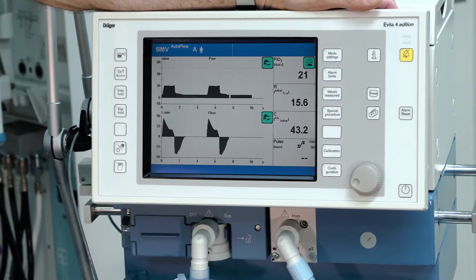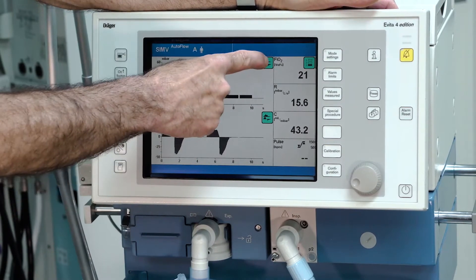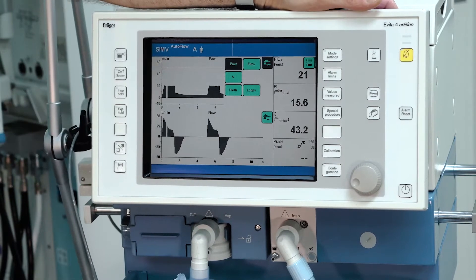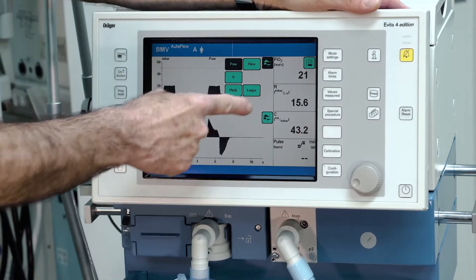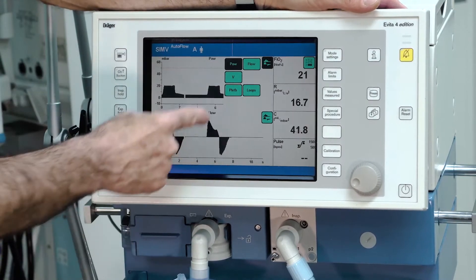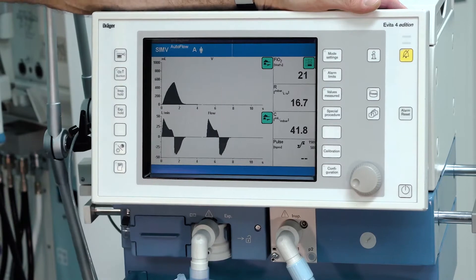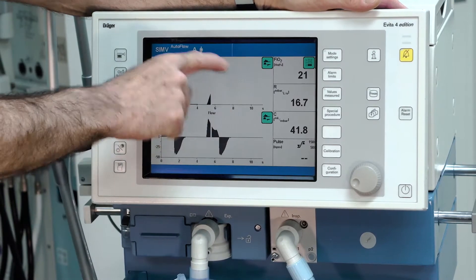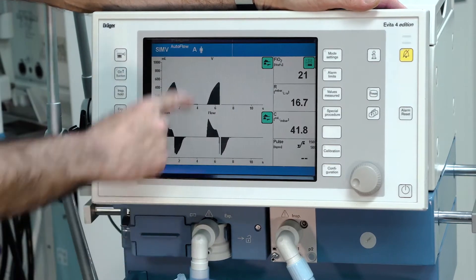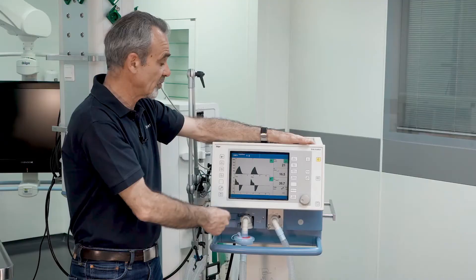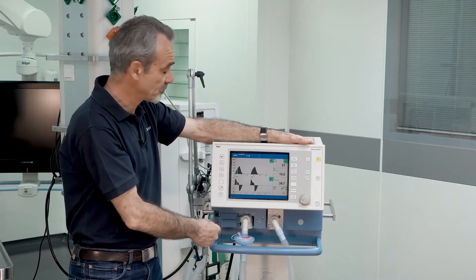To change the curves, just push the button and select the desired curve, and the screen changes from the pressure curve to the volume curve.